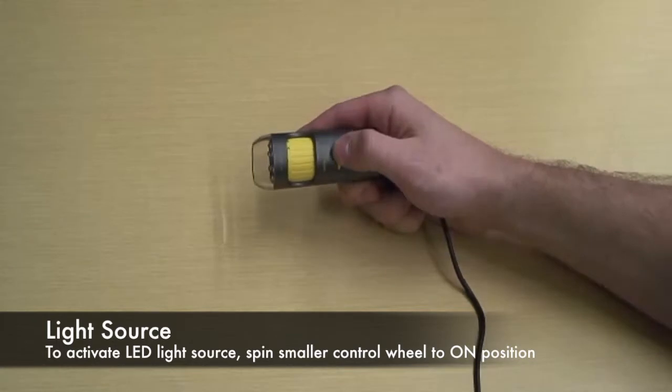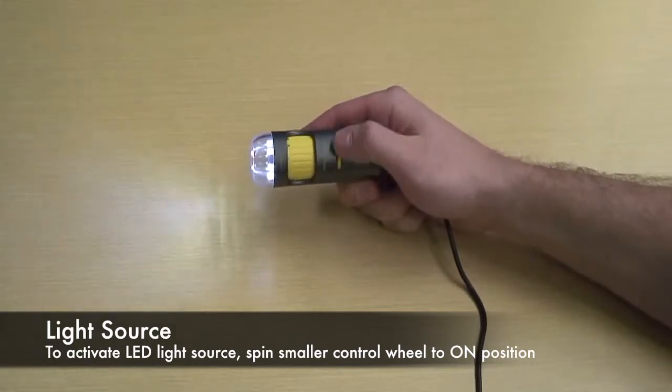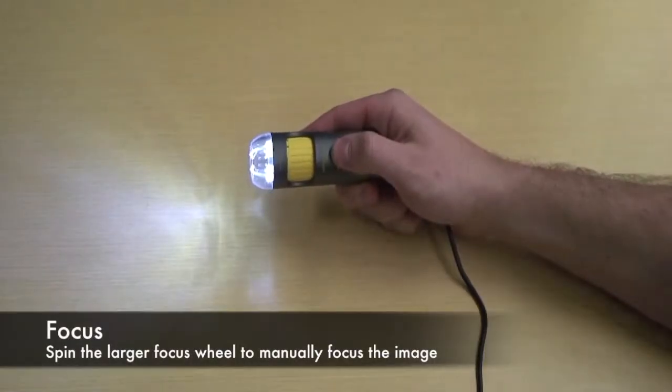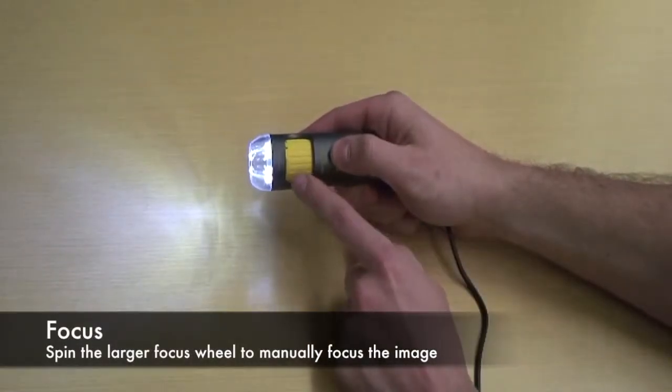The Mighty Scope has a built-in LED brightness control wheel for instant control of lighting, and a large focus control knob for easy focusing.